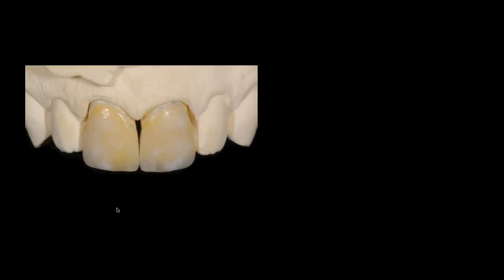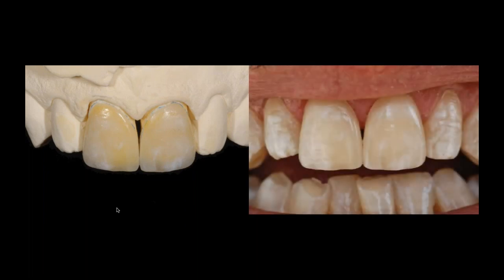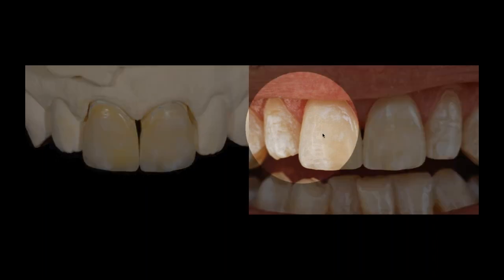And I remember when I sent these back, I got a phone call the day that the doctor was inserting them. And his words to me were, Peter, you gave me a black triangle. That was his words to me. And I thought, I gave you a black triangle? How did I do that? That was not my intention, to not do a good job on the case. I said, well, do me a favor, let me take a look at the picture, send it to me. And he sent me a picture, and this is what I saw.